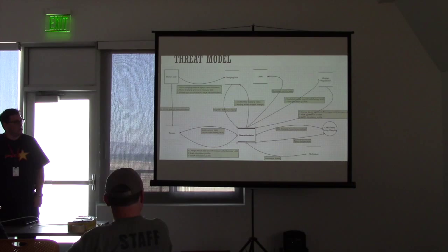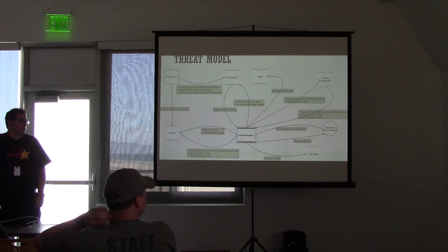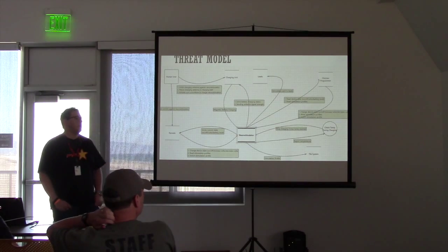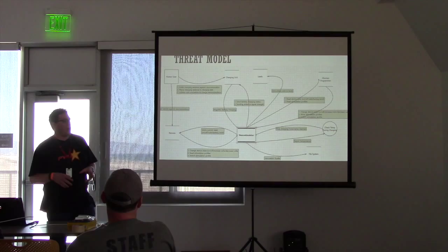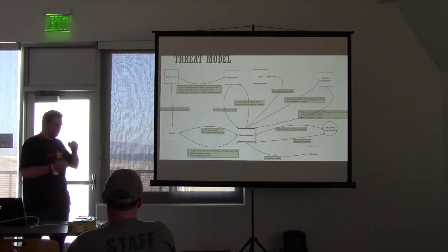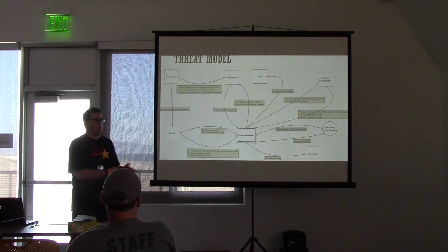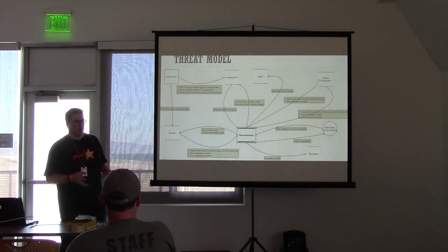How's the device to program the clinician's device protected in the office? It's a good question. I don't know. Well, actually, I do know part. The doctor's office that we went to doesn't have the programmer. So in this case, Medtronic's rep would fly out to program it. She covered a couple states, so she would come out and program it and then fly back to wherever she lived. And if we had an issue, we would call her.